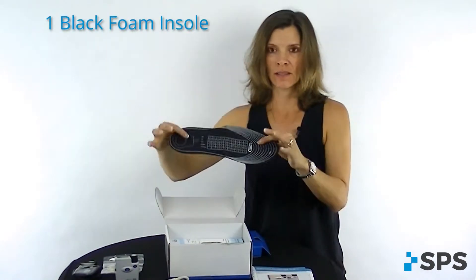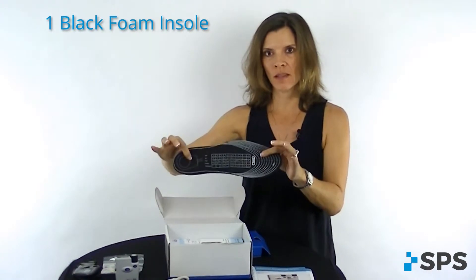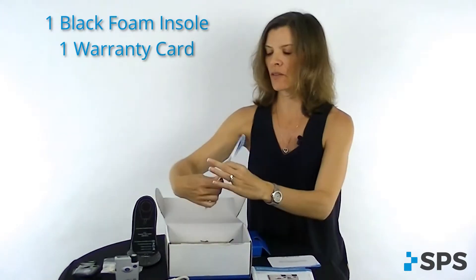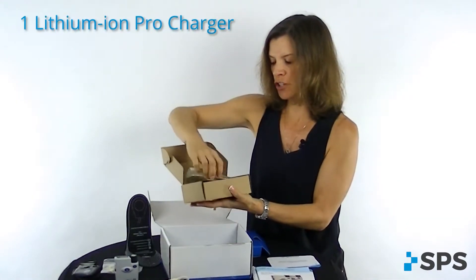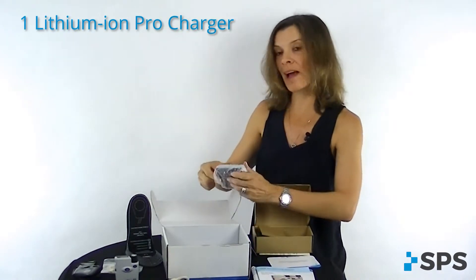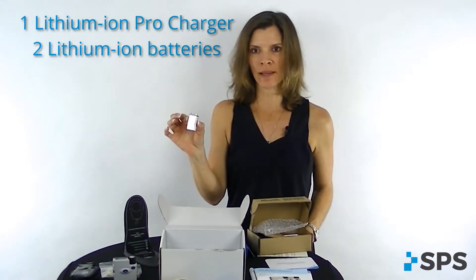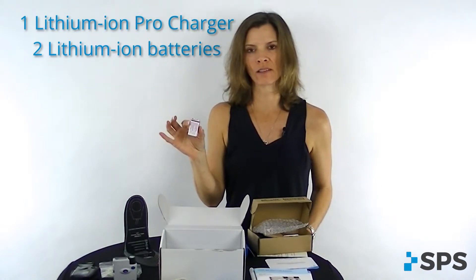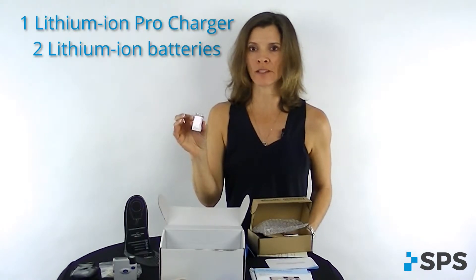There's a black foam insole. This can be used for securing the wireless foot switch in the patient's shoe so that it stays in the appropriate position. You'll have a warranty card — make sure your patients fill out the warranty information. This user instruction manual comes inside your box. You'll get a lithium ion pro battery charger; this charger can actually charge four batteries at a time. The two lithium ion pro batteries that come with the kit can be used for the PaceXL. The patient should always have one fully charged and the other one can be charging. On the PaceXL device there's an indicator, so you or your patient will always know if the battery life is good, fair, or poor.